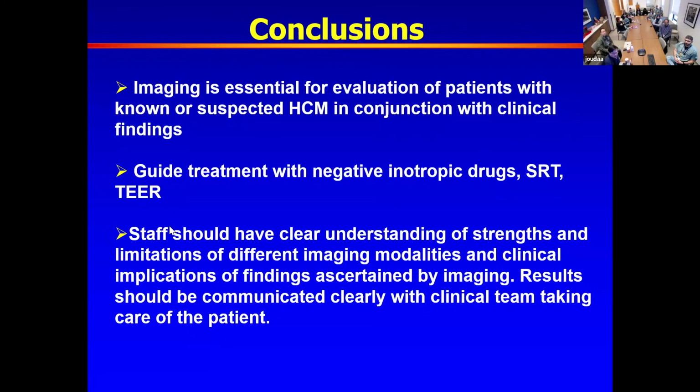I'll start off with one question about the Valsalva maneuver. This is one of our most challenging maneuvers that we want to make reproducible, because often one person's Valsalva is different from another's in terms of making sure we have the highest gradient. What advice or practical ways would you give to make reproducible Valsalva maneuvers so we can assess the gradient appropriately, and other imaging tips as well?